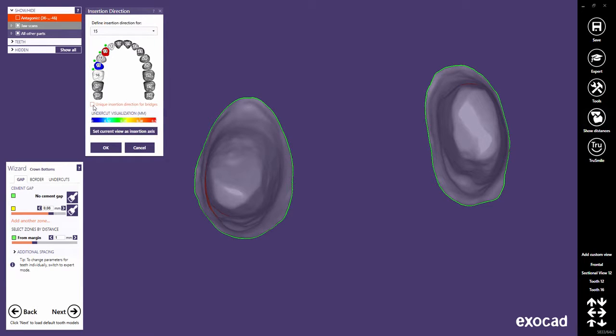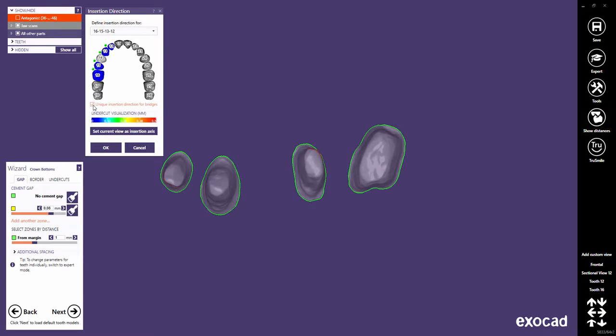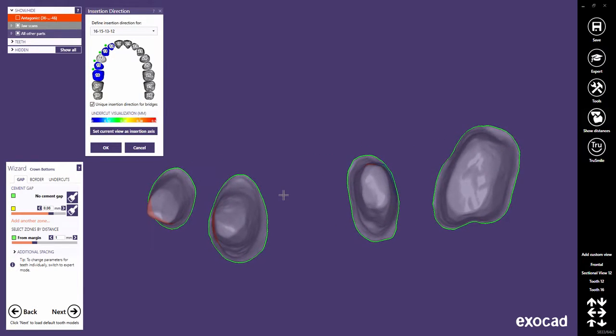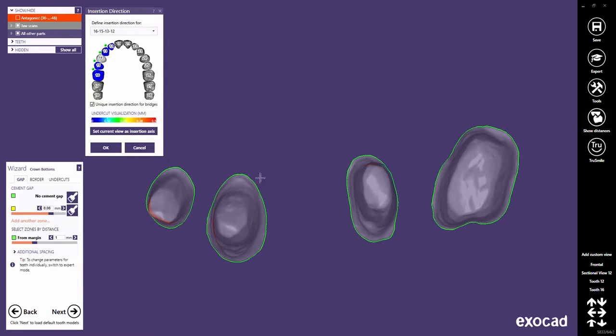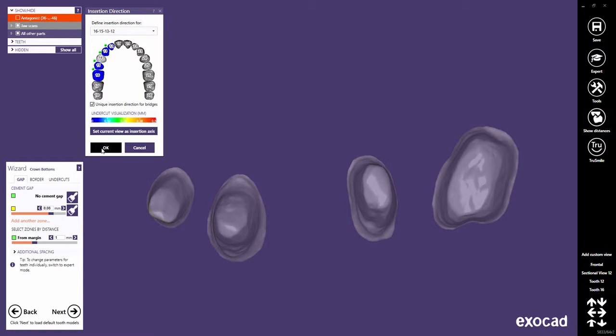Or, check Unique Insertion Direction for Bridges to choose a unique insertion axis for all connected crowns. Note that the software will automatically enforce parallel insertion axis for bridges if a material configuration for 3-axis, 4-axis milling is used. Now, let's choose a unique insertion axis for the bridge and click the OK button to apply the changes to the crown bottoms.